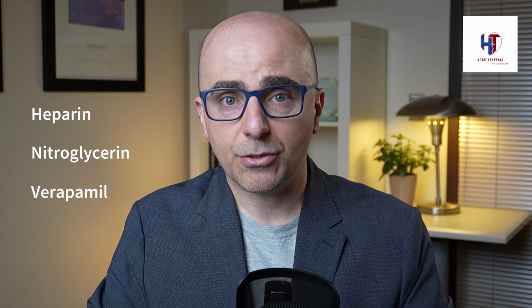The medication we give is heparin as well as nitroglycerin, and another medication called verapamil. This medication is to open the artery of the arm. When we are done with that, we start advancing the catheters. The catheters are flimsy tubes, like a small spaghetti noodle, very flimsy. They go through that IV and all the way around the artery, all the way up to the heart, and eventually engage in the three arteries, as I think I illustrated earlier, and inject contrast dye in these arteries.